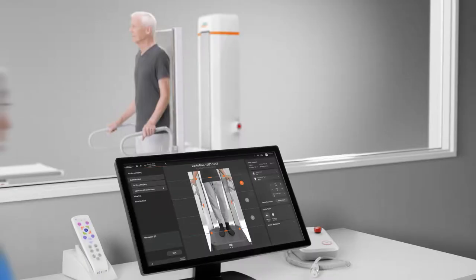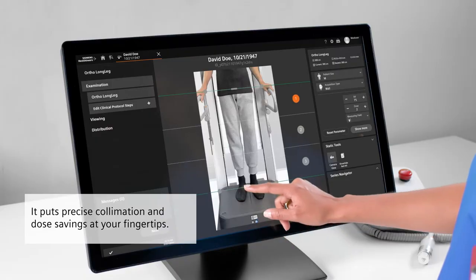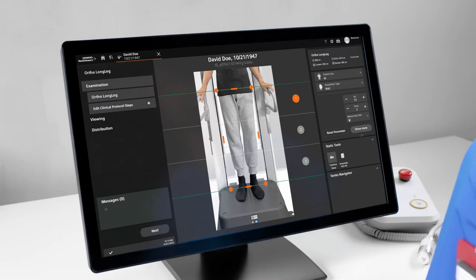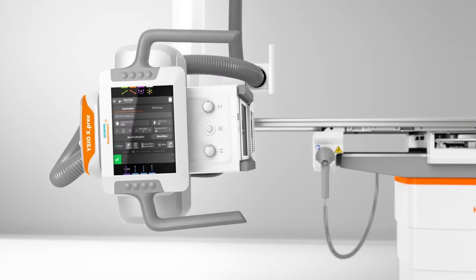The MyExam 3D camera sends a live image of your patient to the monitor. Collimate precisely and adjust dose per clinical image with ease, directly at the touch screen. Patient movements can be detected quickly to avoid unnecessary retakes.